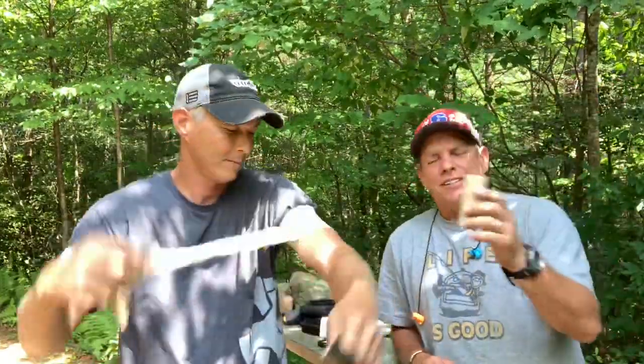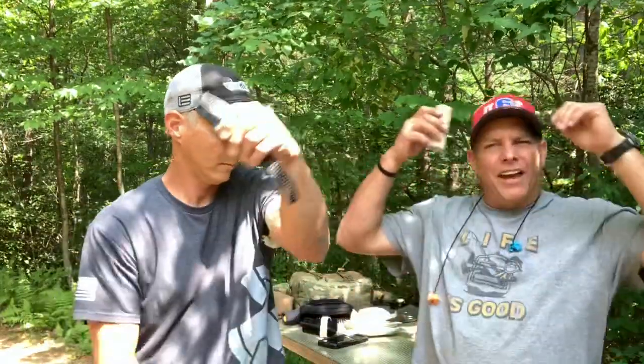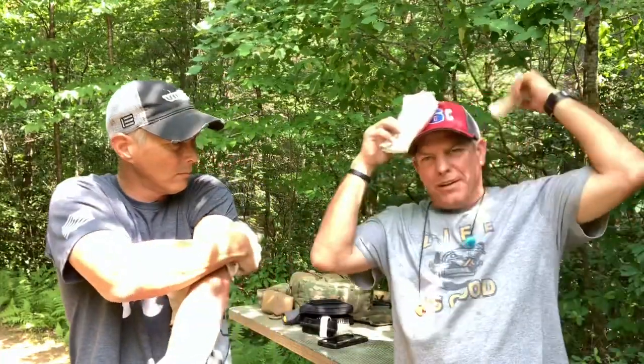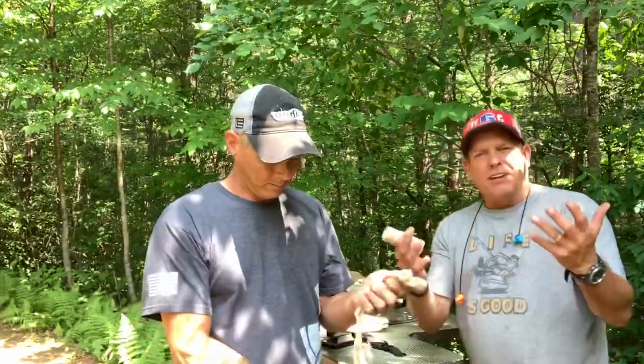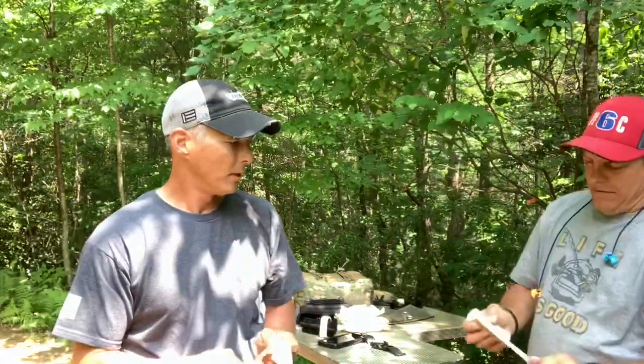The reason why I have this instead of a CAT tourniquet, which I should probably get, is if I have a head injury, I can wrap it, put some of this sterile gauze on here, wrap it. This has some more options, basically, a pair of gloves. But a good medical kit should have a couple CATs in it and some extra stuff for some small minor injuries of some sort. So yeah, it's always good to have something that can control bleeding.